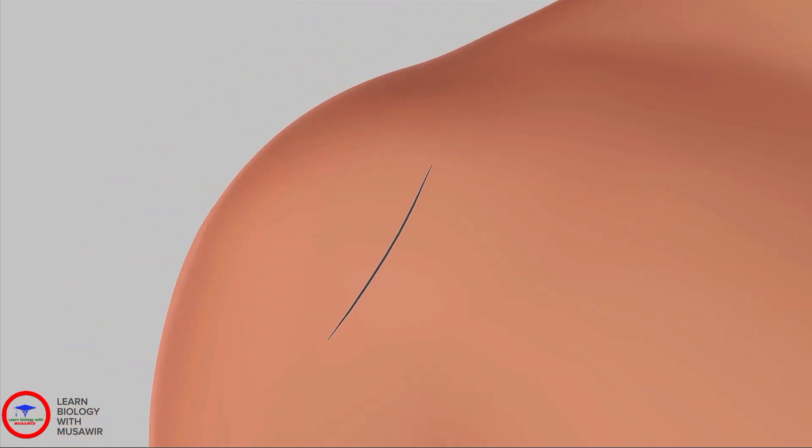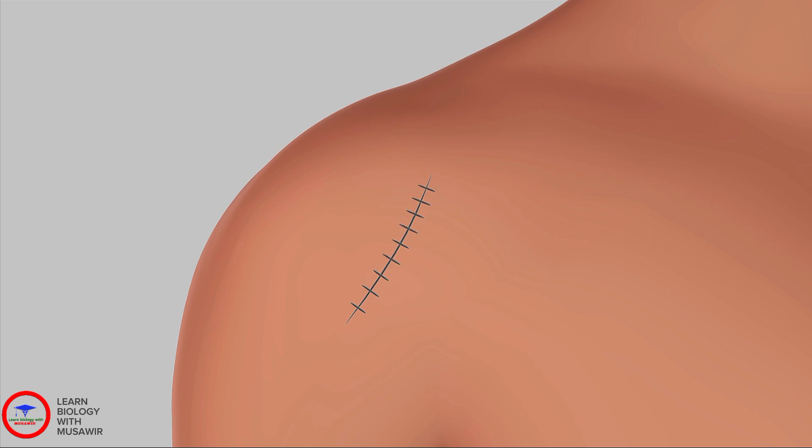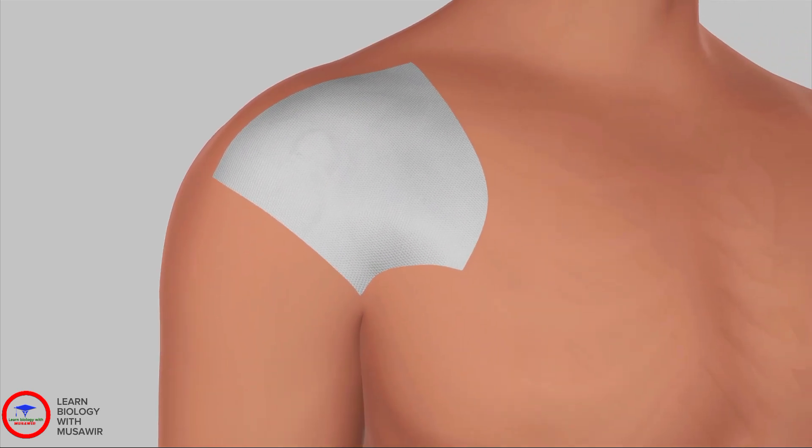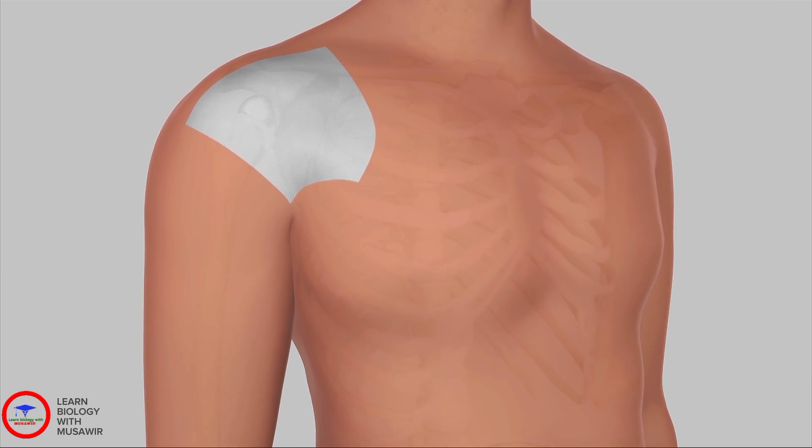Once the implant is in place, the surgeon sutures the incision and applies a dressing. The specifics of recovery and rehabilitation will be determined by the surgeon based on the patient's condition.